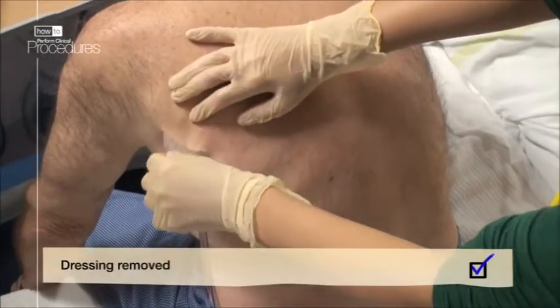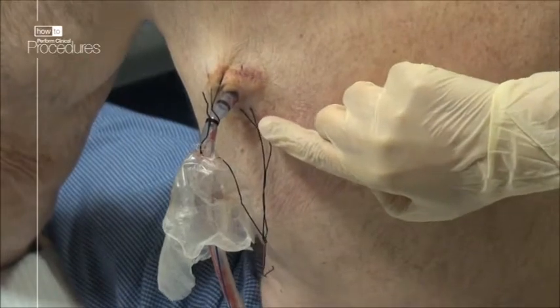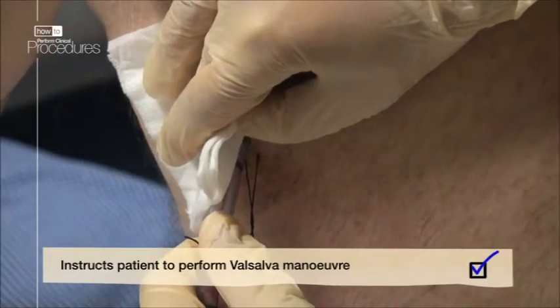First remove the dressing. Expose the suture holding the drain in place and using a blade cut the top holding suture. When removing the drain, ask the patient to make a Valsalva manoeuvre.